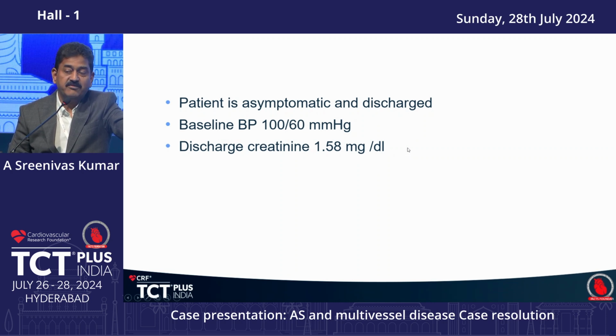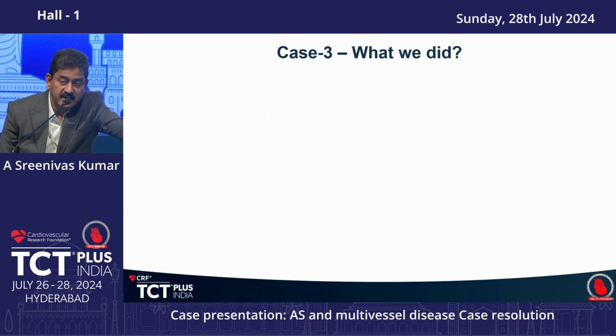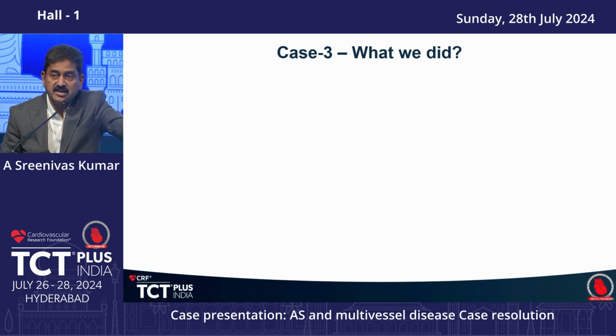He would go back nicely dressed, and people couldn't recognize that he was such a sick patient. That's the beauty of TAVR, and taking care of the heart failure presentation. So we tackled TAVR first and then treated coronary artery disease also.